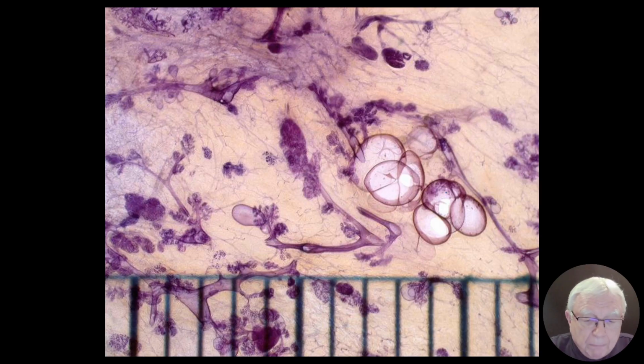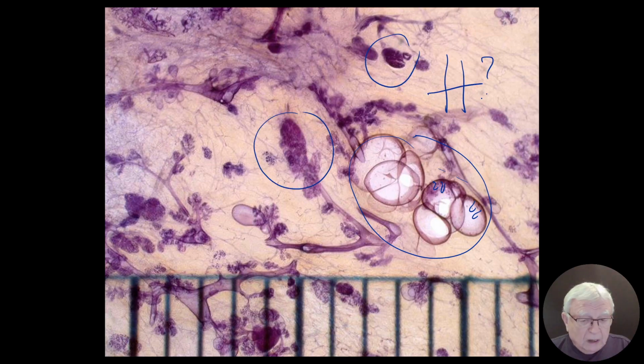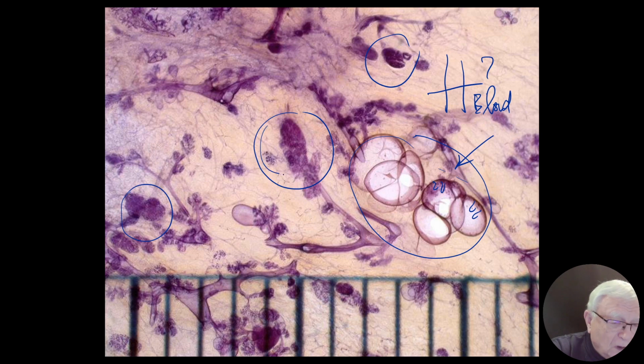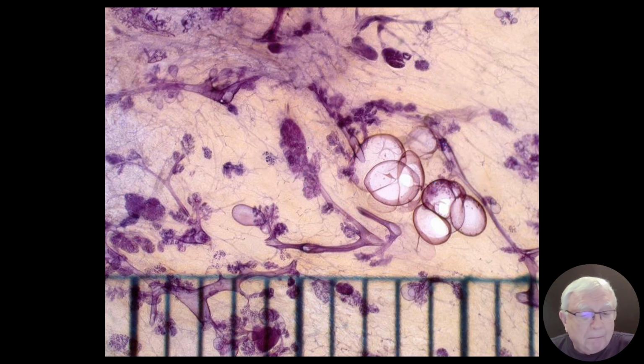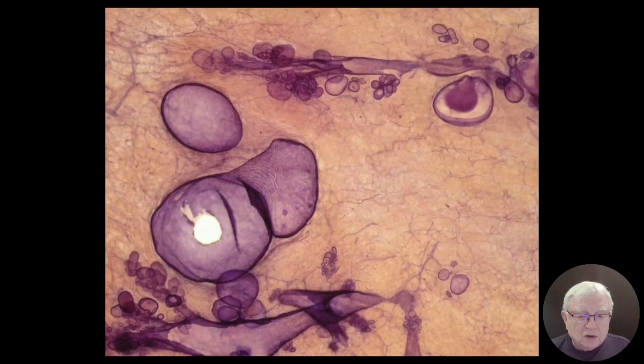How come that apocrine-metaplasia influences this TDLU, but leaves this? We always talk about the hormones. How come? Hormones are in the blood. How come that these reacted and these are not reacting, the so-called hormones? Microcystic fibrocystic change. Please note, this is fibrosis. This is cyst. Fibrocystic change.